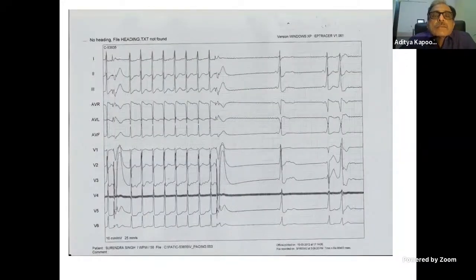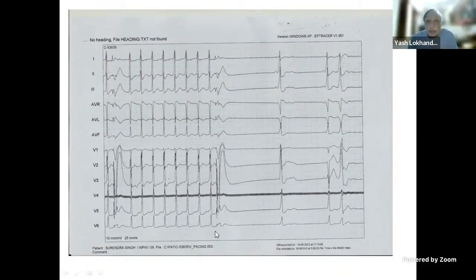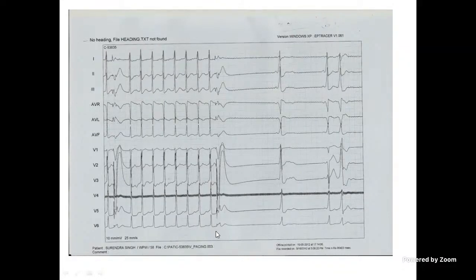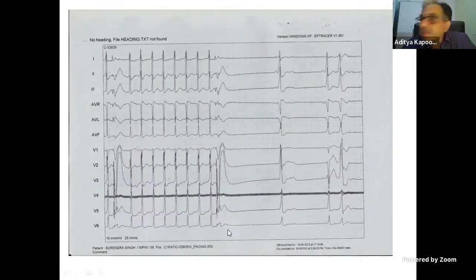Sir, how does this tachycardia terminate and what is happening? So again, a narrow QRS tachycardia, and you are given probably an extra stimulus over here, and it terminates. So what is the diagnosis? You give us the complete diagnosis. AVRT. Why? Good. Perhaps it's a refractory PVC. Sorry? AVRT is the correct diagnosis, but AVRT why? It is absolutely correct.